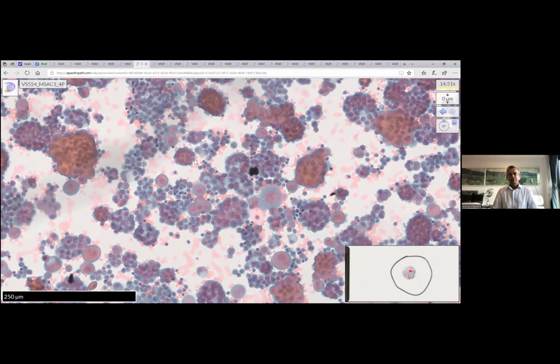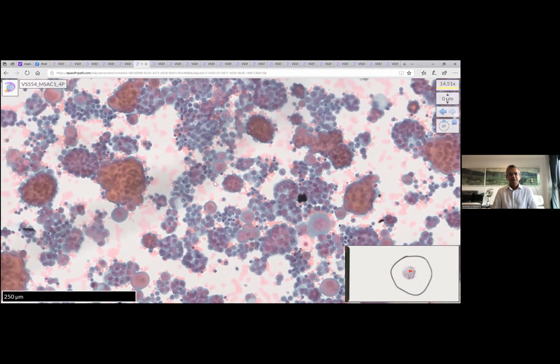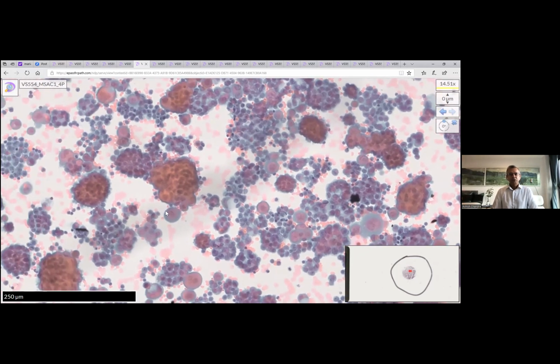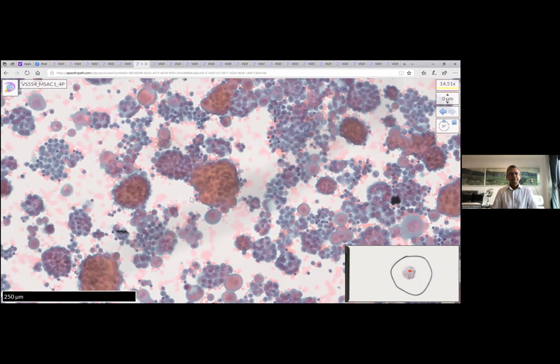Yeah, everyone's going for adenocarcinoma, apart from maybe one. Atypical mesothelial proliferation. Panel for meso versus adeno. Mesothelioma. So quite a mixed bag of replies there, which makes it a great case for discussion.